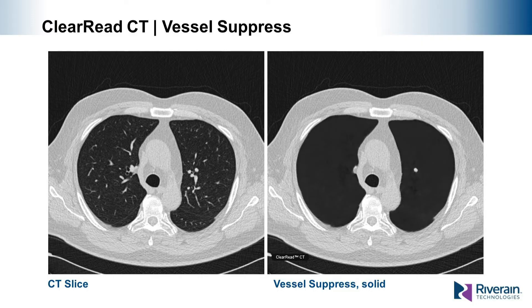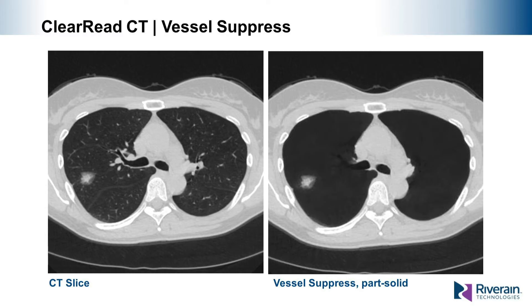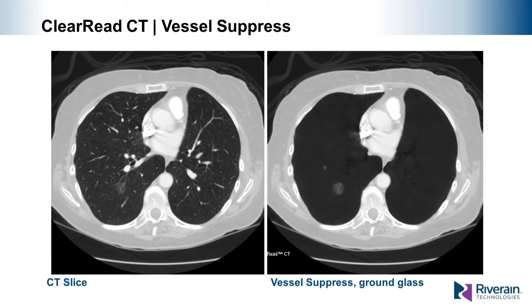Vessel suppression makes detection and characterization considerably more efficient and accurate for both the radiologist and the machine. Here is an example showing a part-solid nodule finding. Given the high reader disagreement when typing part-solid nodules, it's important that both the solid and ground glass components are clearly delineated. Suppressing the vascular structure provides a much better opportunity to not only type the nodule, but to accurately measure both the entire nodule and the solid component. In the case of a ground glass nodule, which can be difficult to detect and segment due to its low absorption, vessel suppression removes the entangled vascular structure, providing an unobstructed view of the nodule and making characterization much easier.